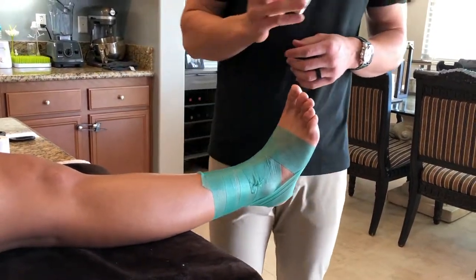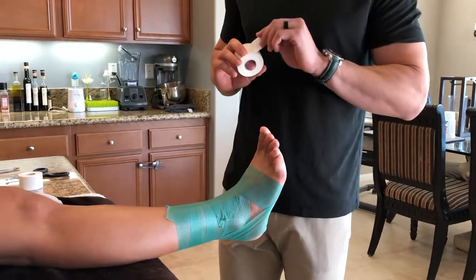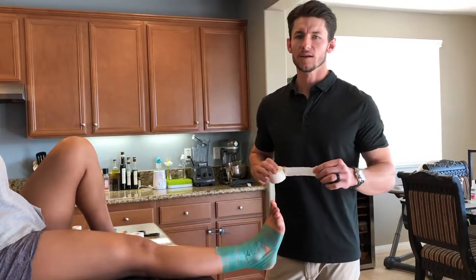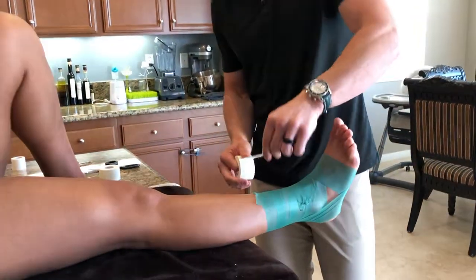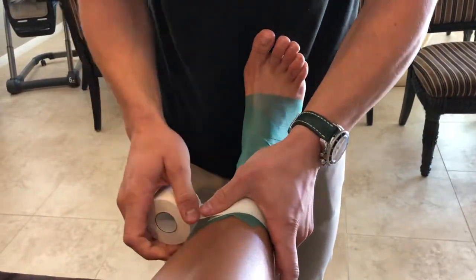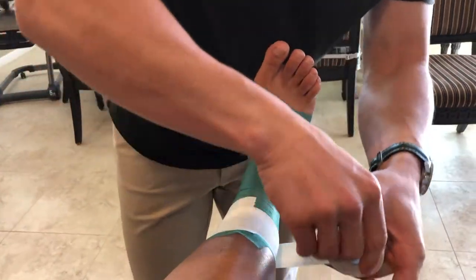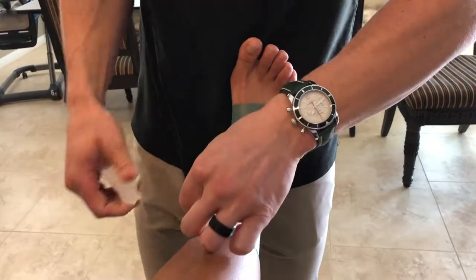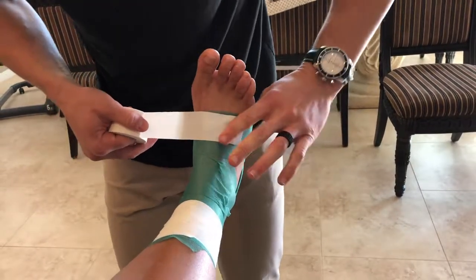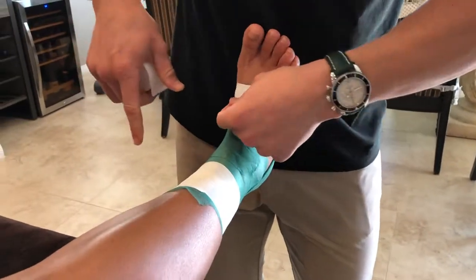After we've applied the pre-wrap, we can go ahead and begin the closed basket tape support for the ankle. The first step is applying our anchors, which serve as the reference for where the tape job starts and ends. We're going to begin right at the base of the gastrocnemius, apply a couple of anchors, overlapping the tape about half the distance of the previous strip. Our distal anchor runs through the arches of the foot, providing our reference point for where the tape job will finish.